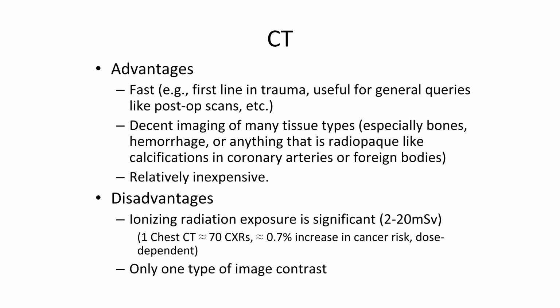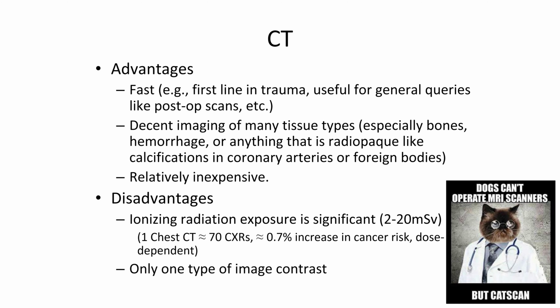The last disadvantage is just that you only get one type of image contrast. It's just how dense is the tissue to X-rays. There is nothing fancy you can do here, unlike MRI, as we'll see.